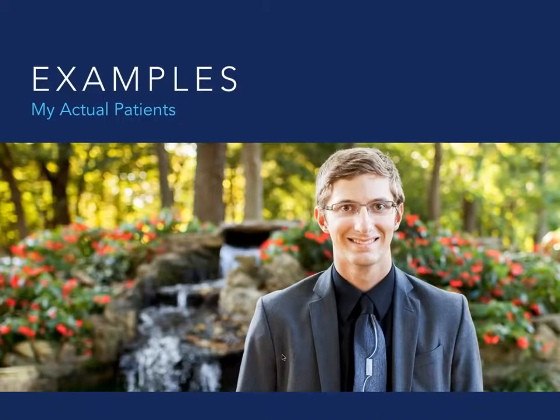And it really comes down to the type of movements that we're going to want to achieve, right? So if we're dealing with some very difficult movements like root torquing, then you're going to have to have a tray that is working on that tooth for maybe a little bit longer than if we're doing simple crown tips and maybe rotations of large teeth like 8 or 9. Those type of movements are going to be much more readily achievable with 3 to 4 day tray changes rather than the torquing of the roots and things like that, the difficult stuff.